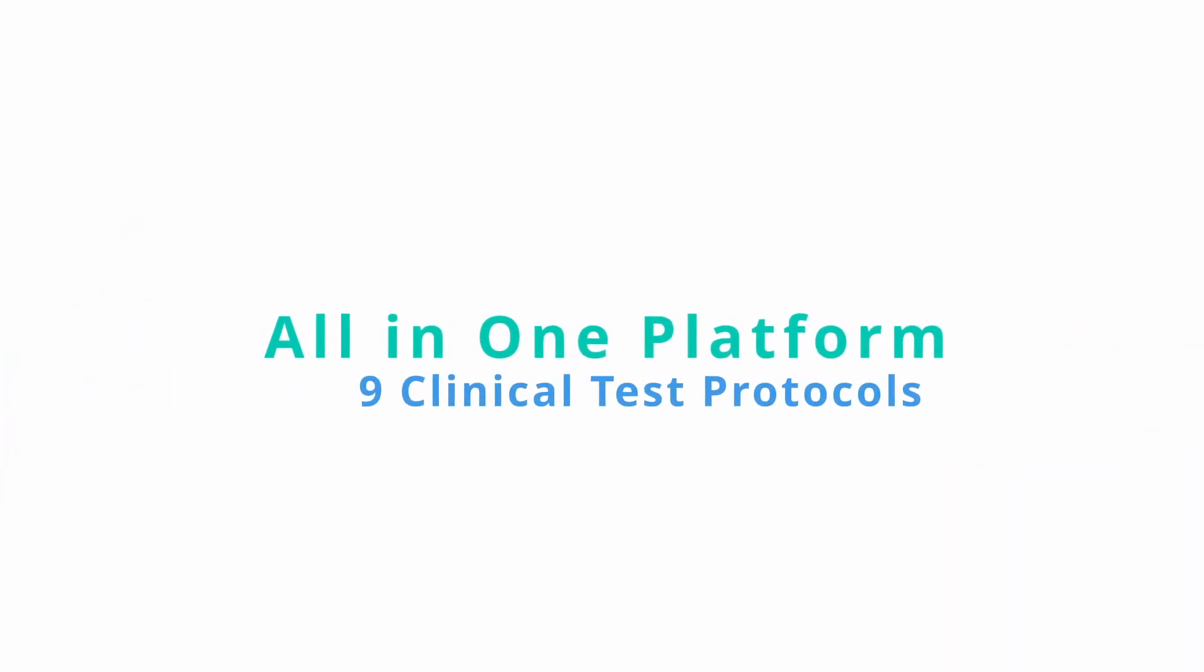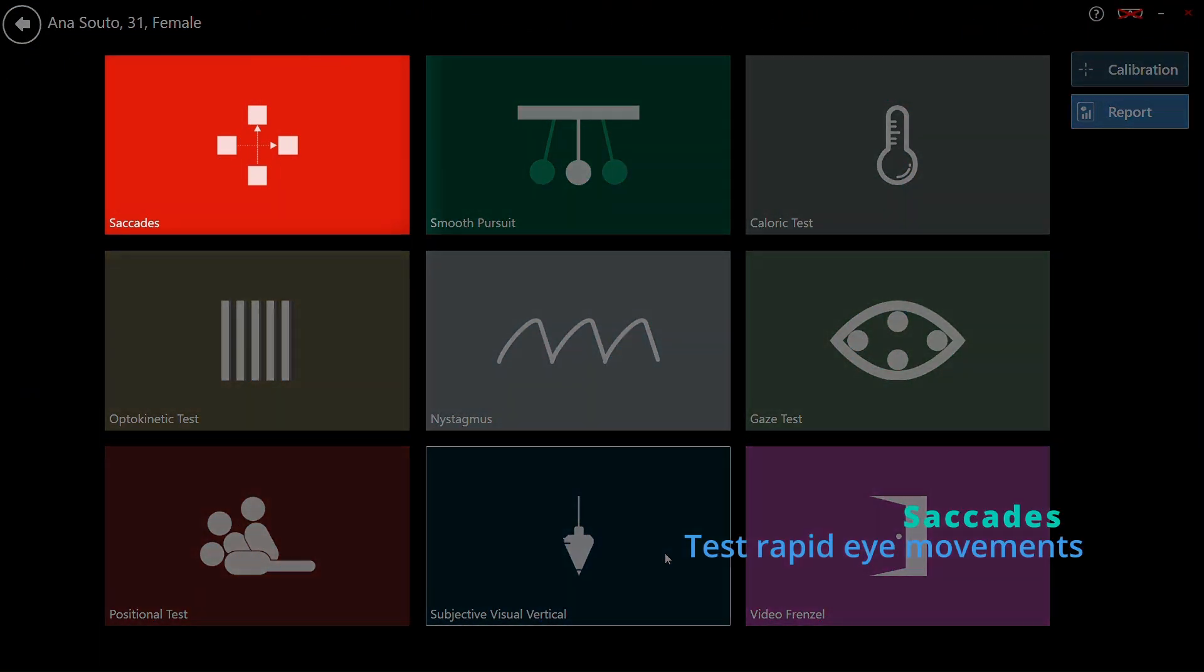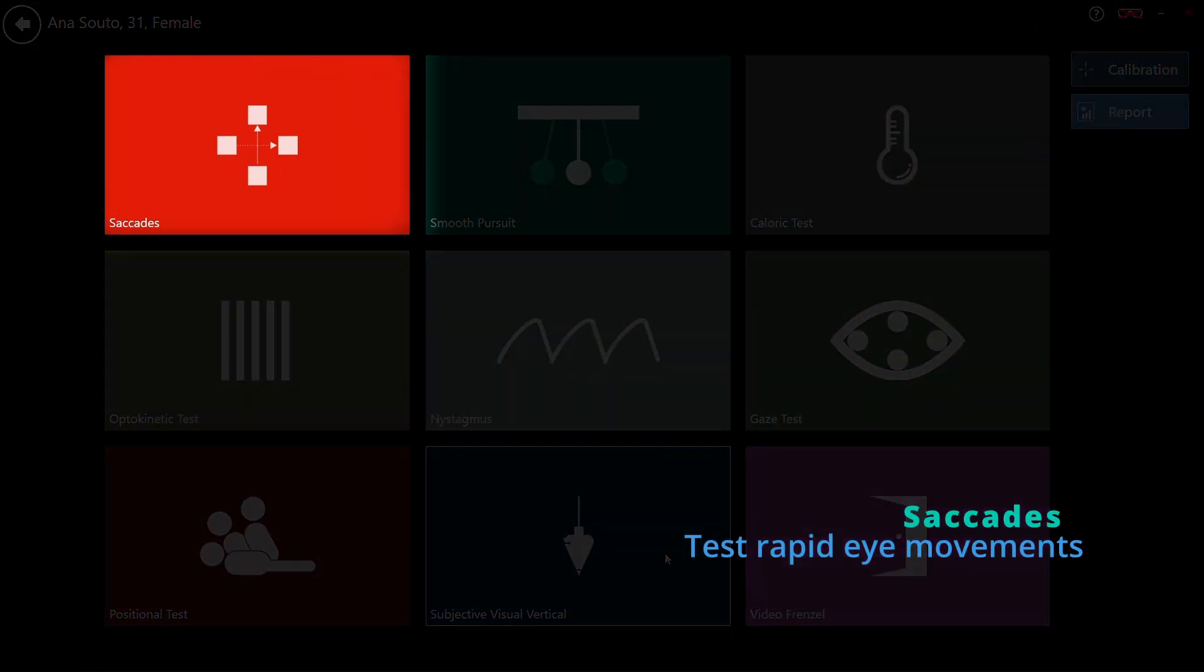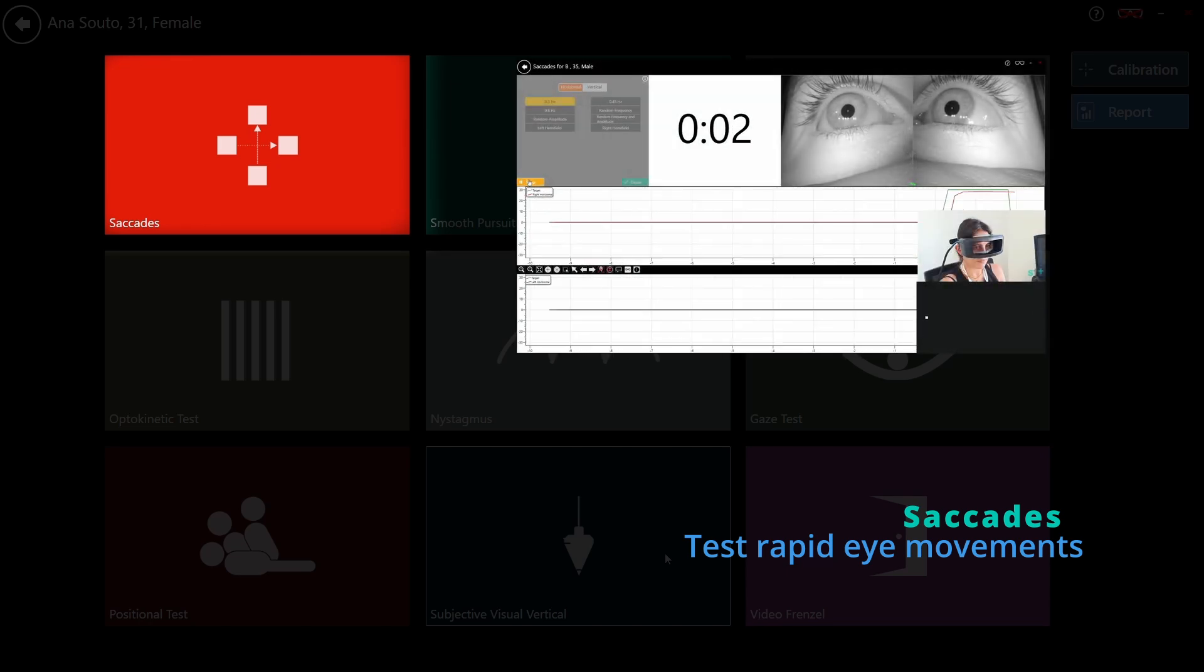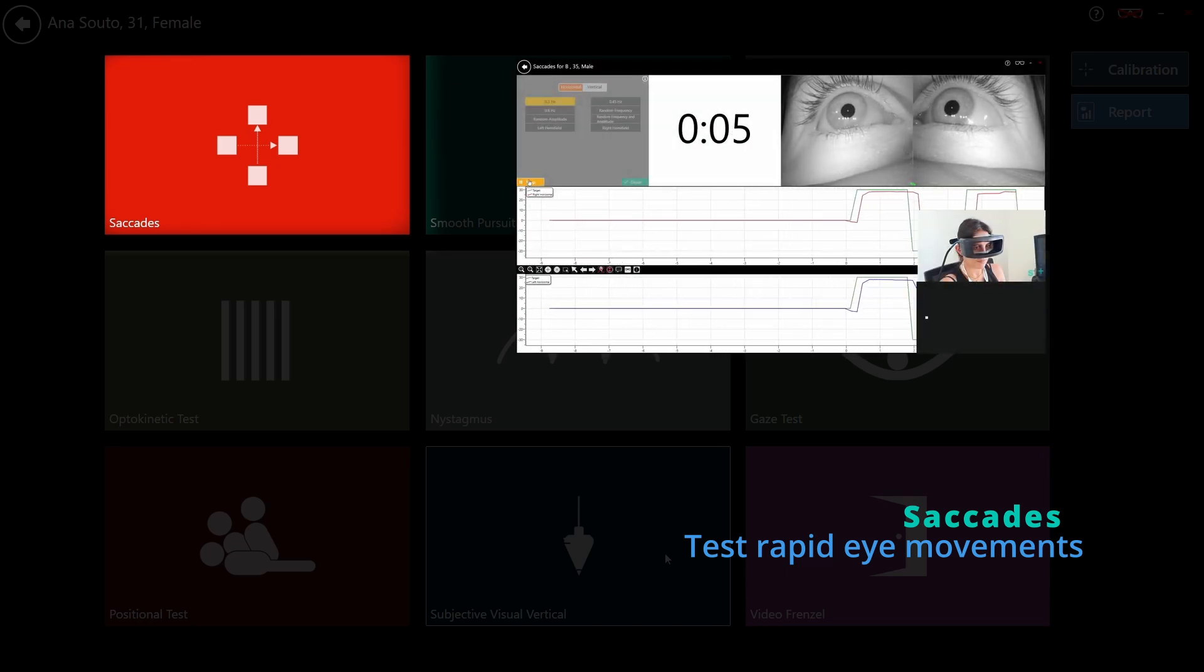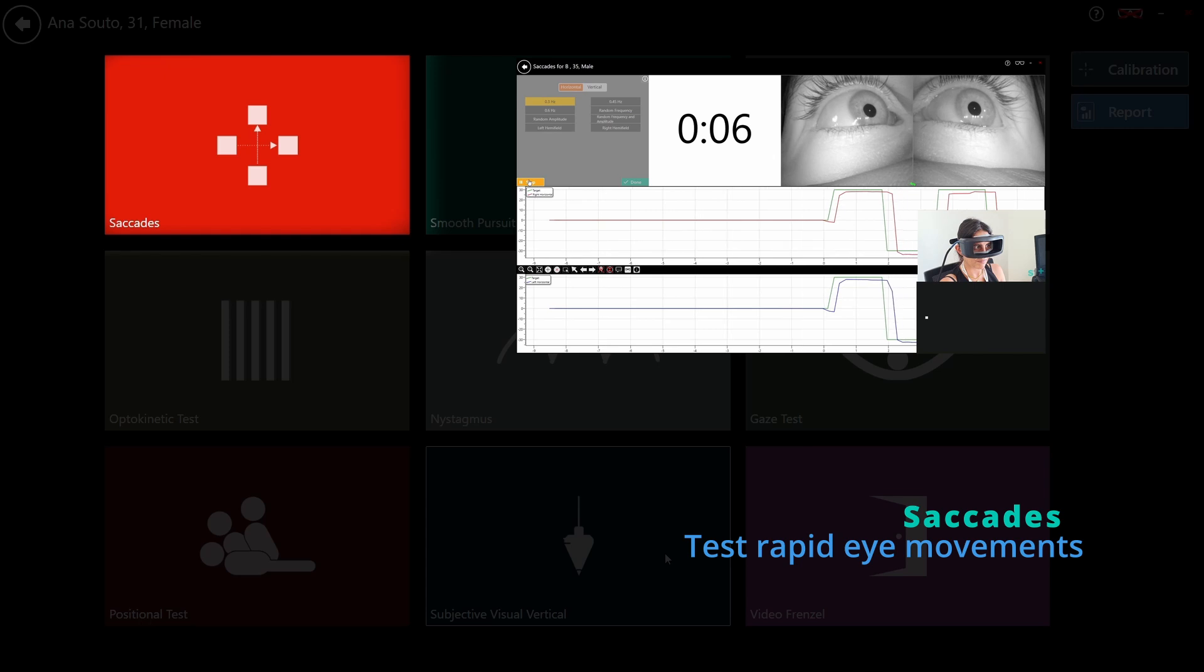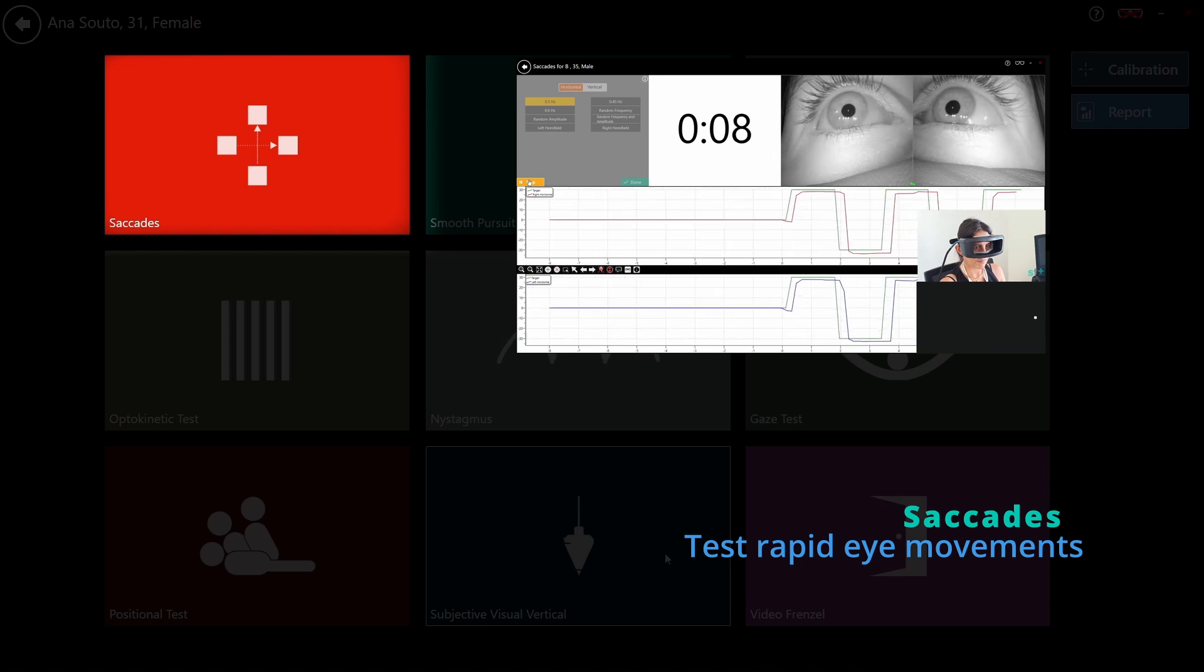The VNGi platform includes nine fully integrated test protocols, standardized, reproducible and clinically validated. This test measures the velocity, precision and latency of rapid eye movements between targets. Both horizontal and vertical variants are available.